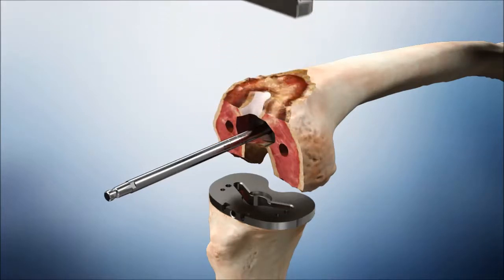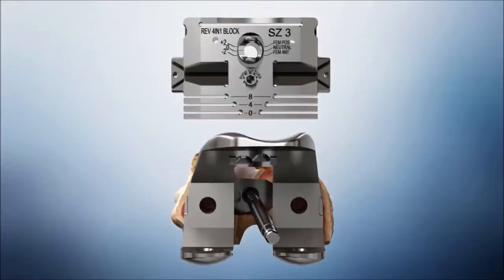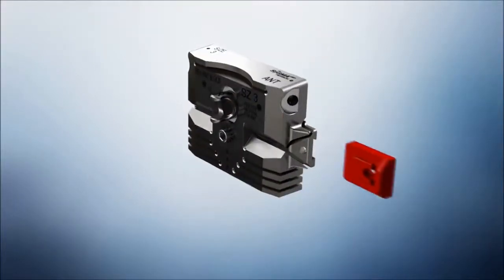Determine the appropriate femoral size by aligning the femoral trial to the distal surface of the femur. The ML width of the trial should provide the femoral size. The ML width of the trial is the same as the revision 4-in-1 cutting block. If a distal augment was prepared for in the distal resection, the distal spacer should be assembled to the corresponding side of the revision 4-in-1 cutting block by sliding it in from the side.